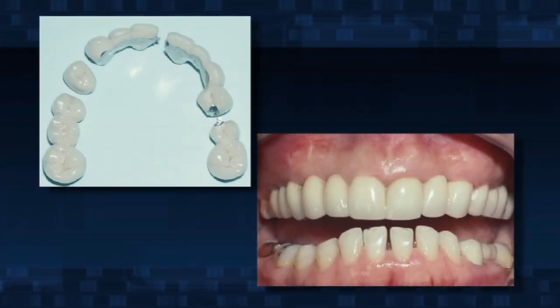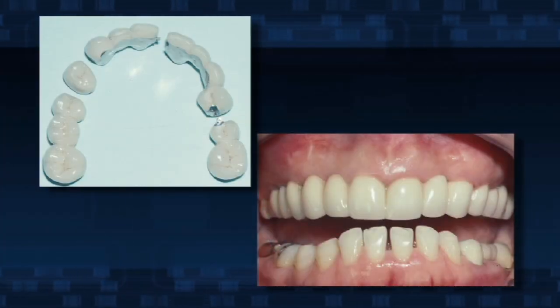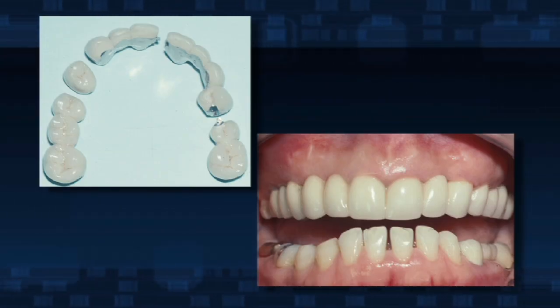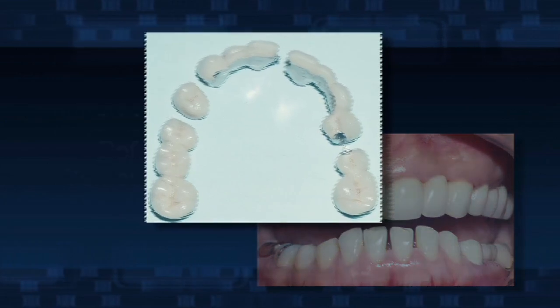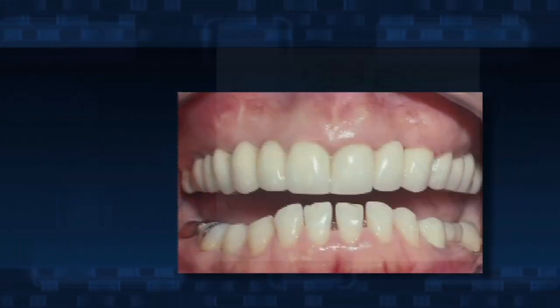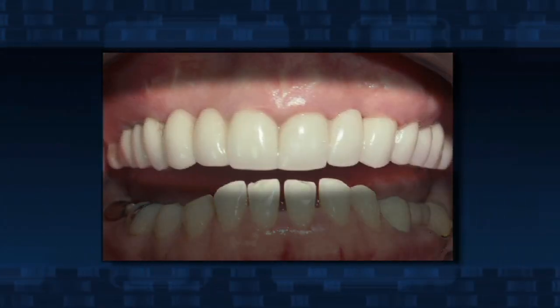Now the bridge has to be cemented into the mouth, and it will then become a part of the patient's body. It cannot be removed by the patient. Well-made fixed bridges are very difficult to detect from natural teeth. The patient feels like it's his or her own teeth. Note the bridges as they were made by a dental laboratory technician and the aesthetic result as they were cemented into the mouth. The patient should expect many years of service from these bridges.